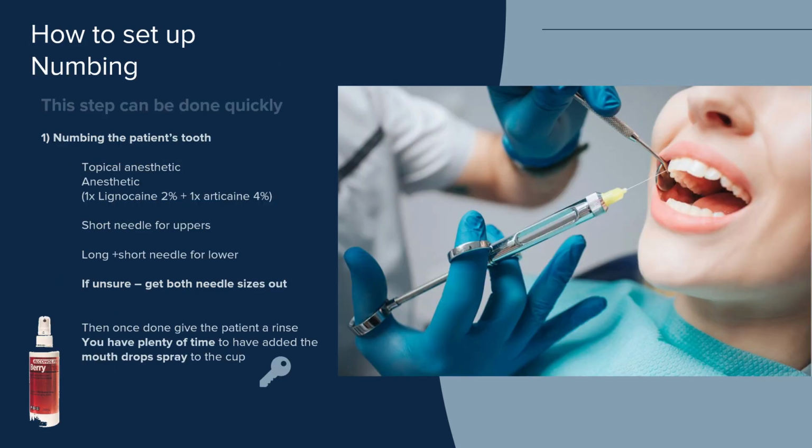So again, this root canal can be done quickly. I know a lot of DAs dread setting up for root canal. I don't see why. It can be set up quickly if you remember what step you're doing. So the patient comes in, we're going to numb the tooth. You're going to put topical. I like to have one lignocaine and one articaine ready.